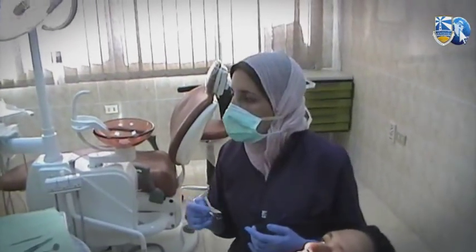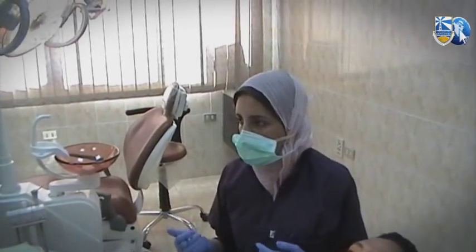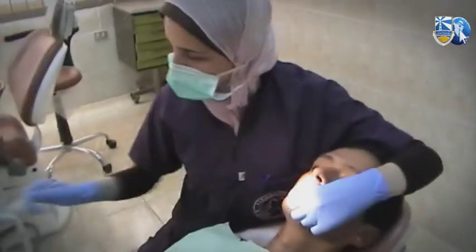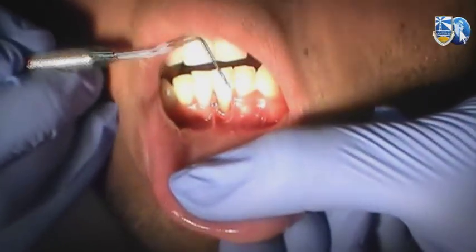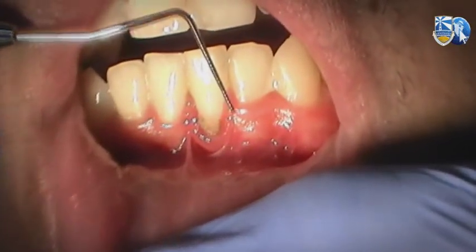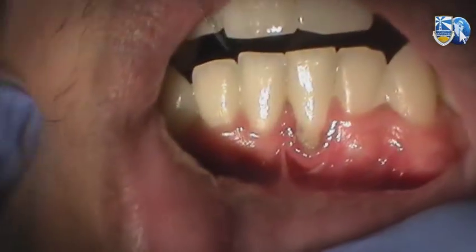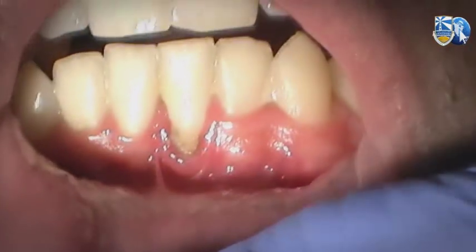I expect that in this patient, since we have an abnormal area in the lower anterior region, we will not find stippling there. Let's see. We do not have stippling here in the center of this papilla.